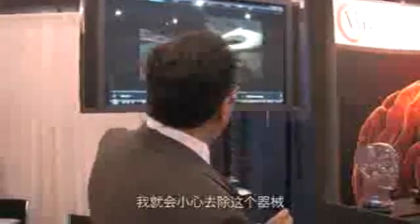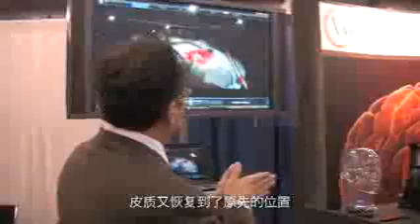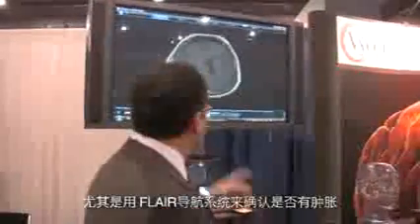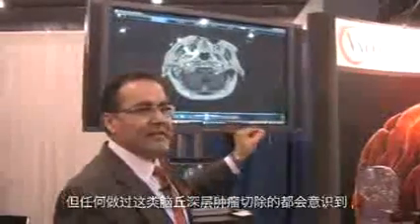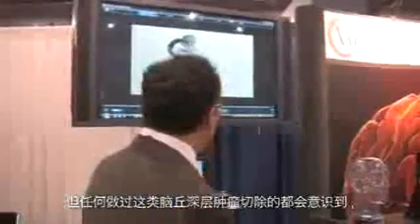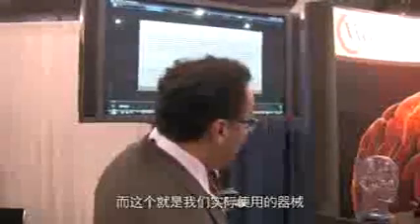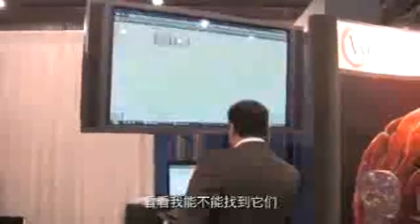The tumor is done. I go ahead and remove the device very carefully. As you can see, it's a very flexible arm, which is the Greenberg in this case. We remove it, and you can see the cortisectomy just falls back into place. Sean is quantifying very scientifically with imaging, especially the FLAIR navigation, whether or not there's any swelling, and that's the actual resection. It's not a complete resection. There was a little bit of tumor, but anybody who has done a tumor this deep in the thalamus recognizes that these are very, very challenging lesions, and that's the actual device that we use. I'm going to move to the other two cases that I have. See if I can pull them for you.